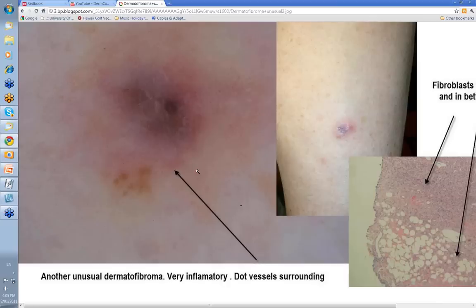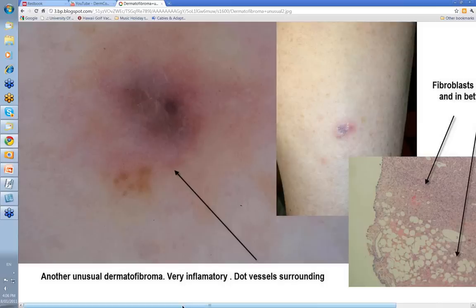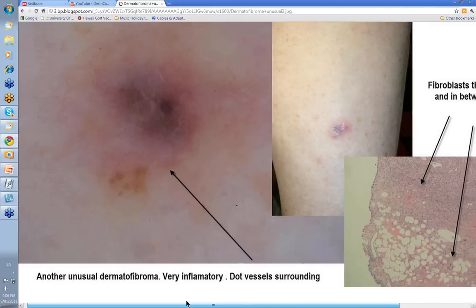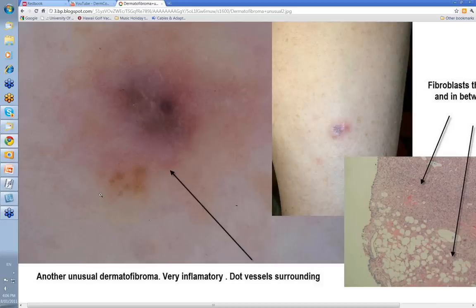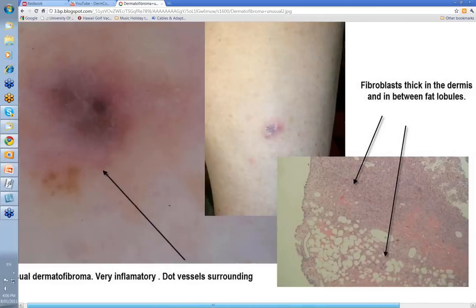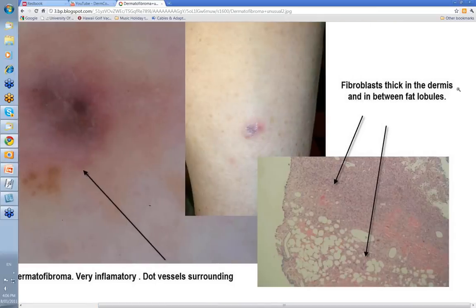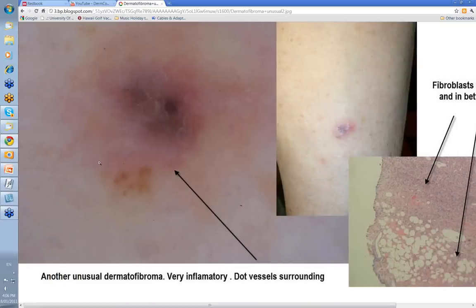This is another variant of dermatofibroma. You can see the variation in the pink color and the dark blue in the center, and there is a hemosiderotic variant of dermatofibroma that can look somewhat like this. Again, you've still got a little bit of brown lines reticular here, you've got some white structureless area, blue-gray structureless in here as well — you might think that's a blue clod. Altogether an unusual variant. When you look at the histology, your fibroblasts are thick in the dermis and they're extending in between the fat lobules here as well. This is the pattern that you'll see in dermatofibromas.